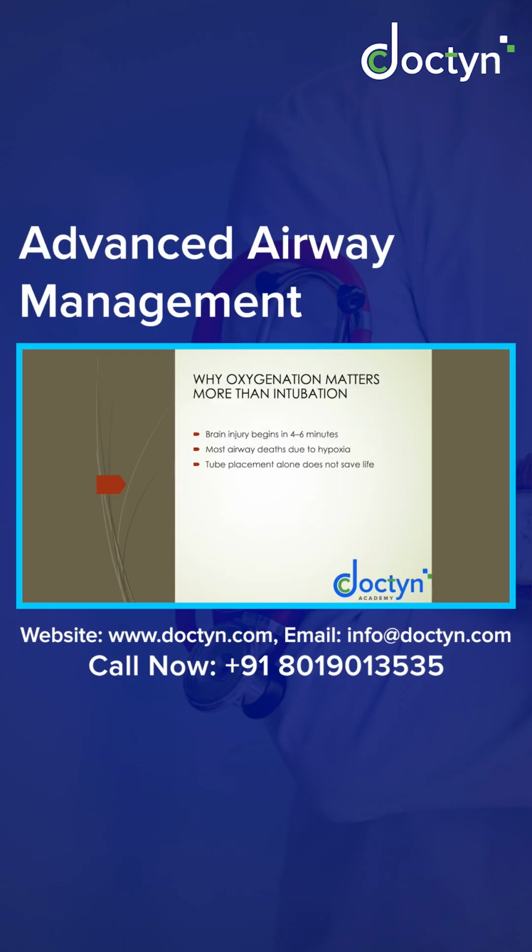As we discussed already, oxygenation always matters more than intubation. What most doctors or physicians feel is that airway management is mainly focused on putting some gadgets into the mouth. But it is not putting some gadget across the vocal cords or across the oral cavity. It is always oxygenation that is paramount.